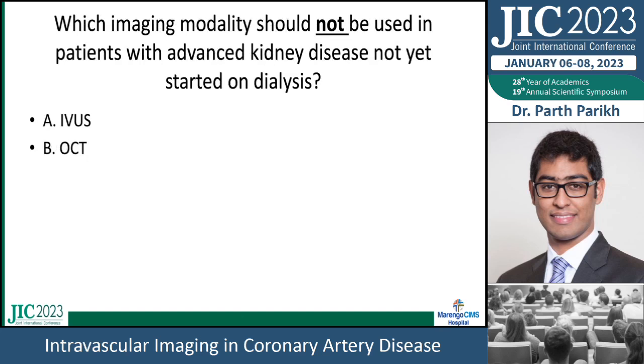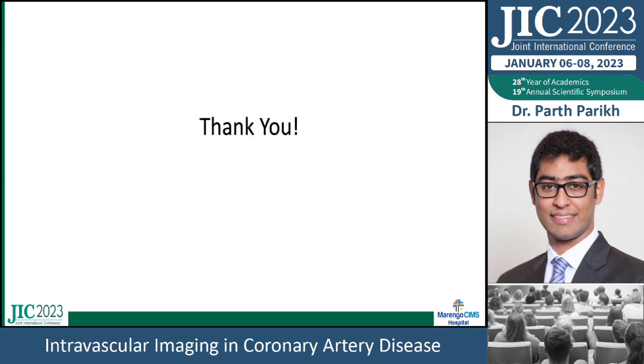Which imaging modality should not be used in patients with advanced kidney disease not yet started on dialysis? IVUS or OCT? So you don't want to use OCT in patients who have not been started on dialysis yet, because the most important thing is that you will be giving contrast for OCT images. So with this, I would like to thank you all, and thank you for your attention.